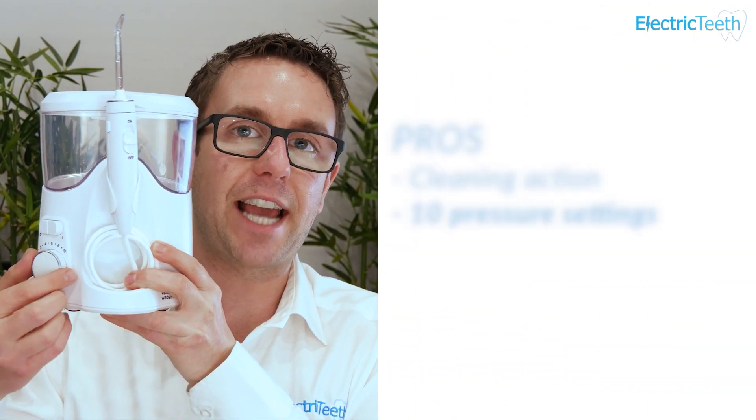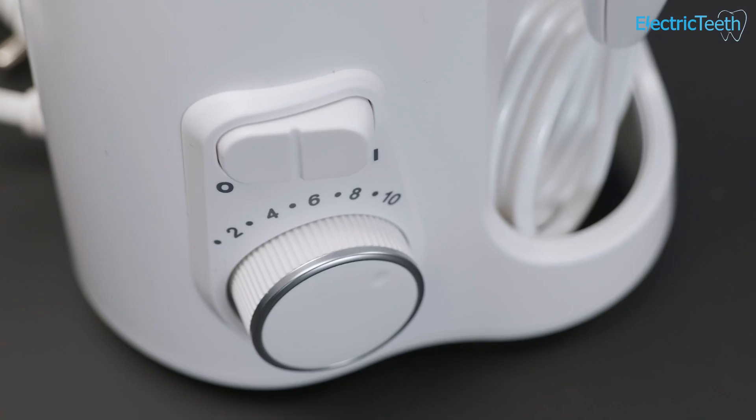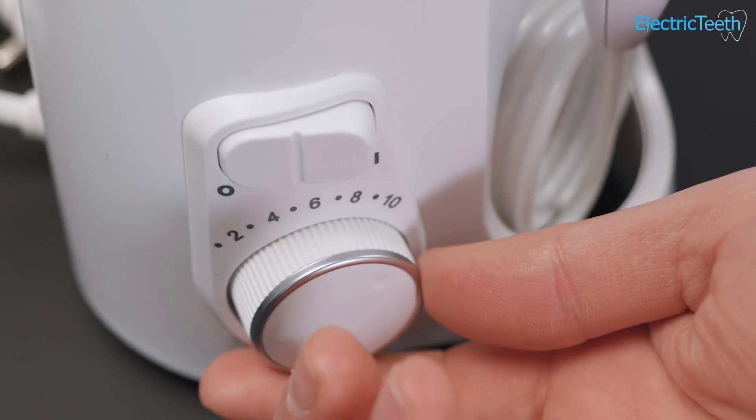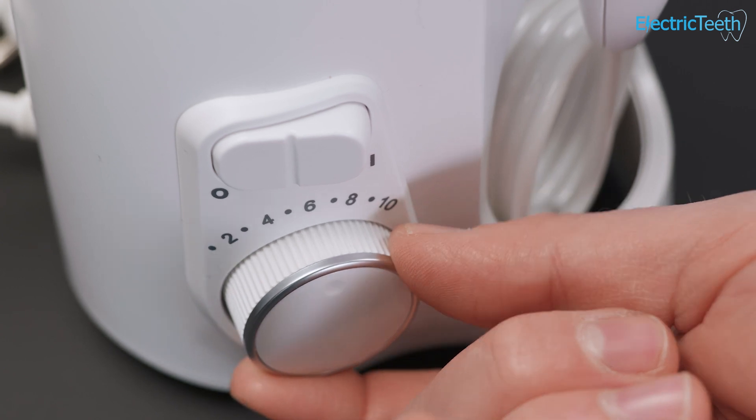Another pro has to be the 10 different pressure settings. Via this rotating dial on the front of the unit you can change between 10 different settings which range from 10 psi all the way up to 100 psi — setting 10 is the most powerful. Most people are probably going to want something between five to eight. I typically settle around seven or eight, so that's about 70 to 80 psi, which is more than enough to flush out all of the debris between your teeth and give a good cleanse.